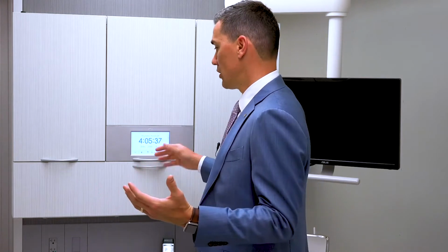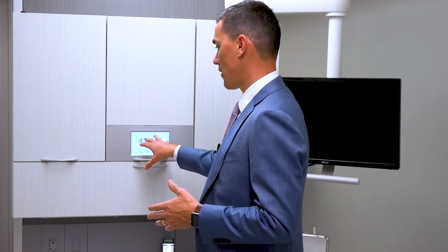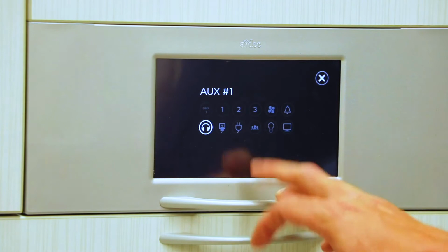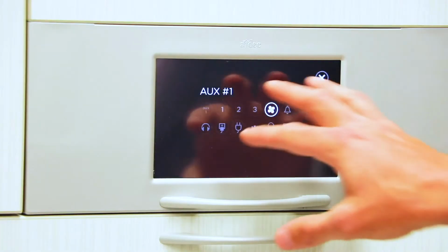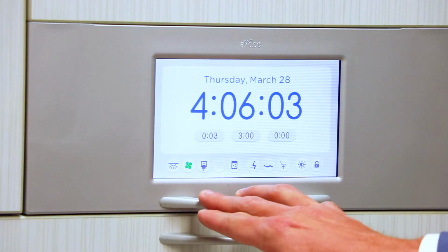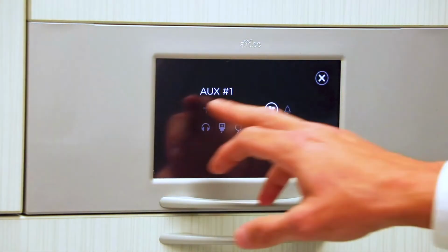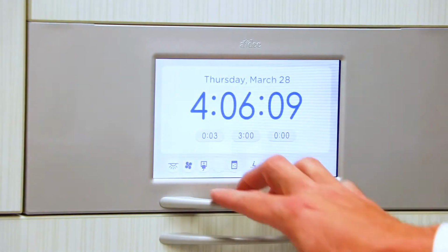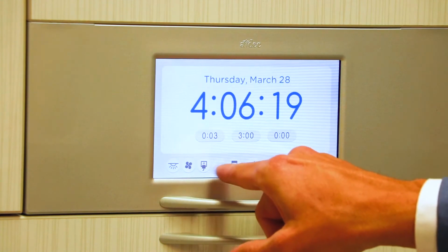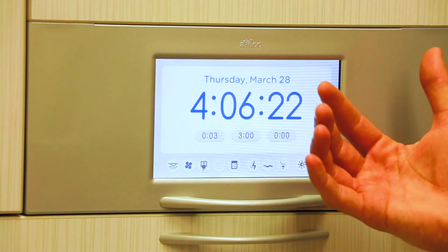We have a couple of different options as far as what we want to wire into the auxiliary channels on this touchpad. If we wanted to change that functionality, we could change it to headphones, we could change it to some type of plug, whether it's another stop clock or something like that, a fan in the operatory, anything like that. We could change that auxiliary button to whatever we want to store that as. And then that button will change the icon as well. And we can cycle through as far as what we want for that. And it's just by tapping it, we can turn it on and off. These three buttons right here allow us to control any auxiliary low voltage item if we would need.